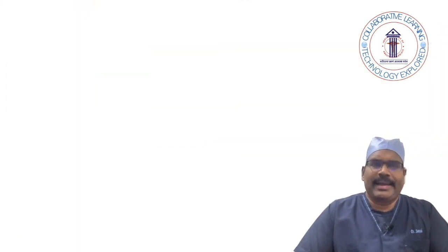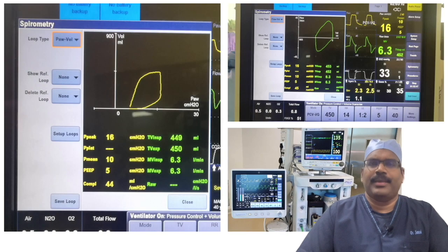Now I would like to highlight some more features. These are pictures from GE Care Station 620. Here you can navigate to see the pressure volume loops and flow volume loops, which can give us lots of clues to intraoperative respiratory events. Moreover, we can use this screen to familiarize our residents with these loops and teach the dynamics during each respiratory phase.